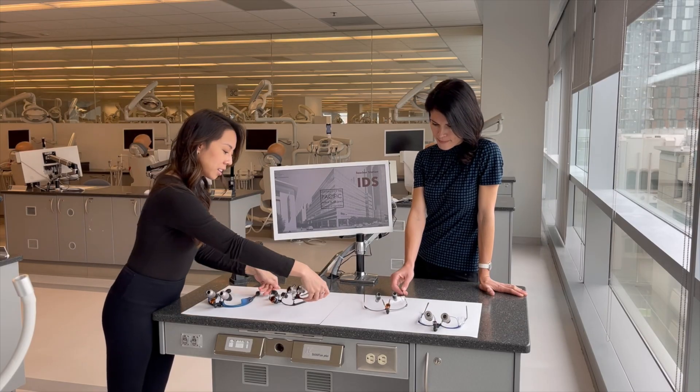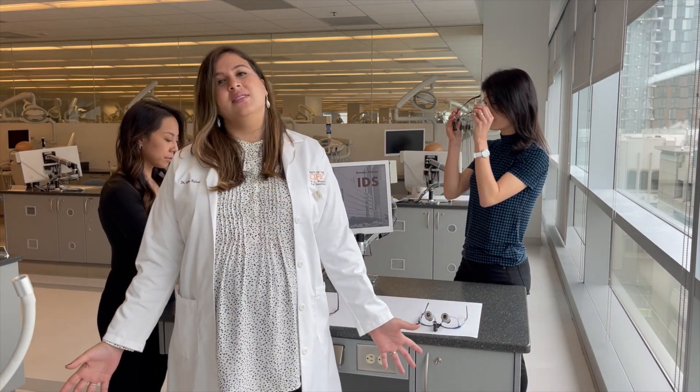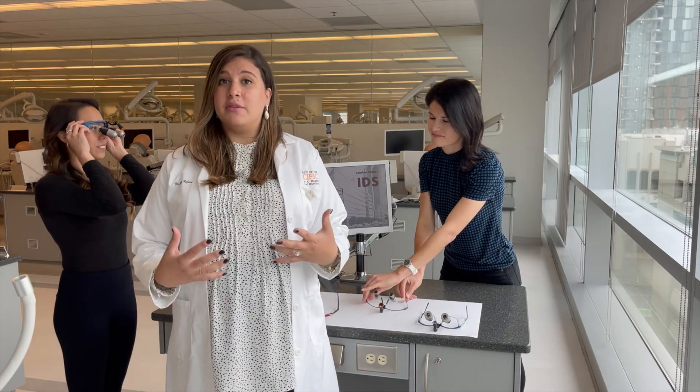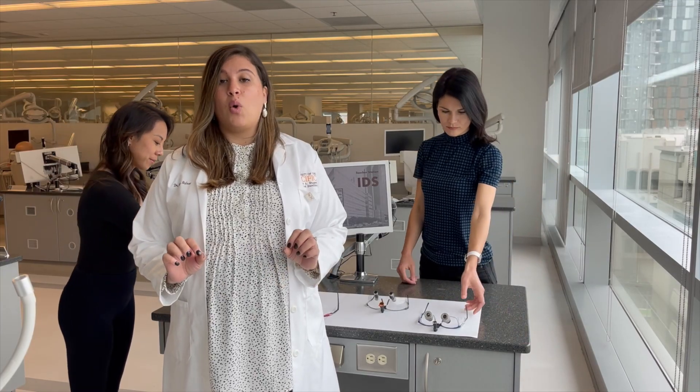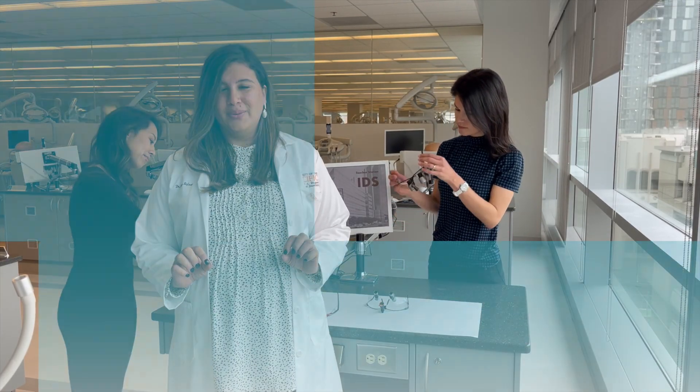This is a dilemma you will soon face when it's time for you to choose your first pair of dental loops. There are many choices and it can be very confusing, but one thing we can tell you is that there are many more aspects to consider than just how your new loops look on you.